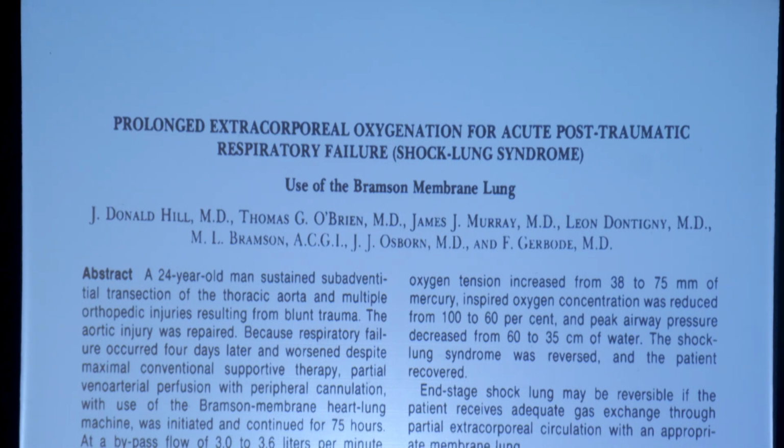As well, they decreased the oxygen concentration from 100% to 60%, so spared the overt oxygen toxicity. And they also decreased the peak airway pressure from 60 centimeters to 35 centimeters of water. So the very high vent settings, the very severe hypoxemia, the very high oxygen requirement, all were mitigated by this extracorporeal strategy. And this patient survived.